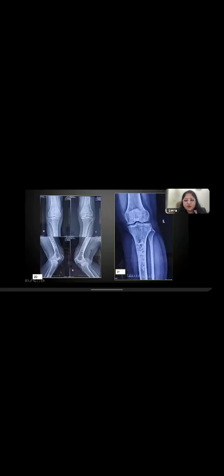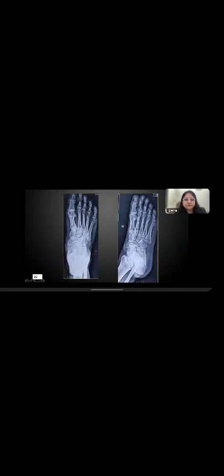One differential diagnosis would be enchondroma, I don't deny, but medullary infarct is the thing that you should remember. Some of these X-rays are not mentioned in many places, but with this kind of appearance, medullary sclerosis and large lesions in long bones, think of bone infarcts or medullary infarcts.